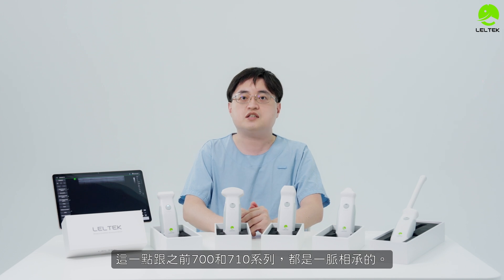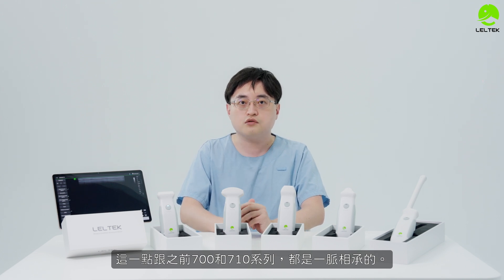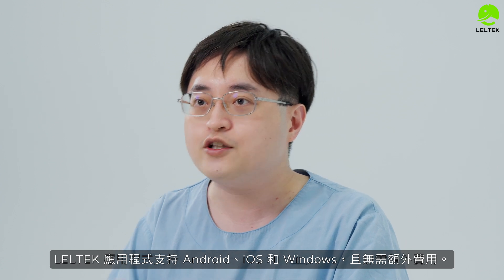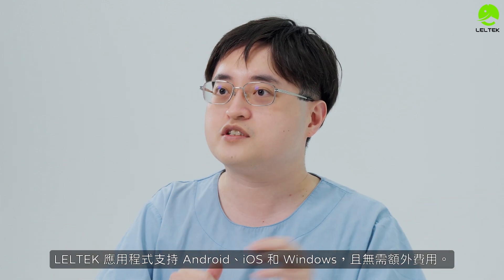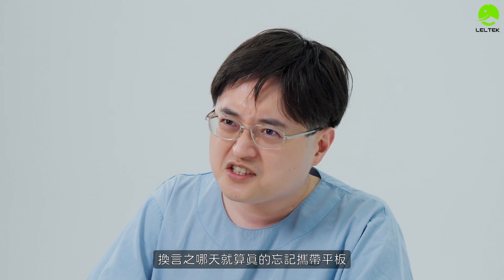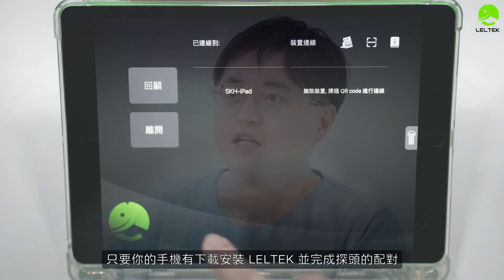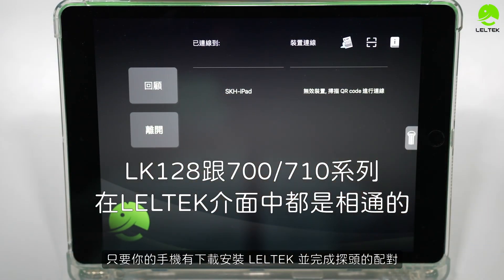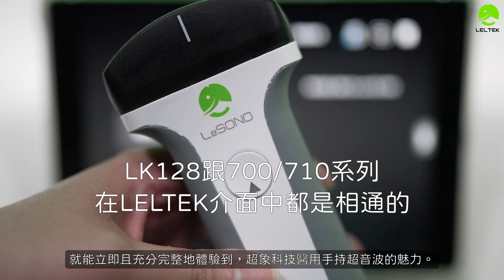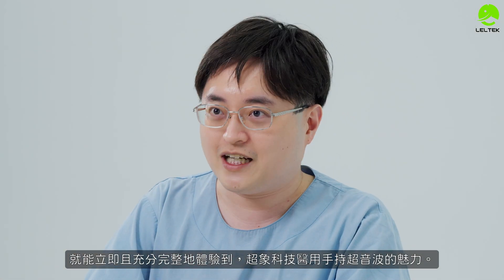This one, like the previous 700 and 710 series, uses the same LELTEK approach. LELTEK supports Android, iOS, and Windows — with no need to pay extra. Even if you forget your tablet, if you have your phone you can download and install LELTEK, and start using it to fully experience the technology.